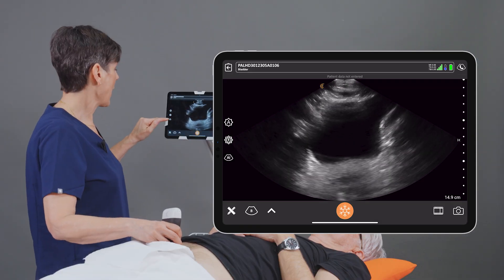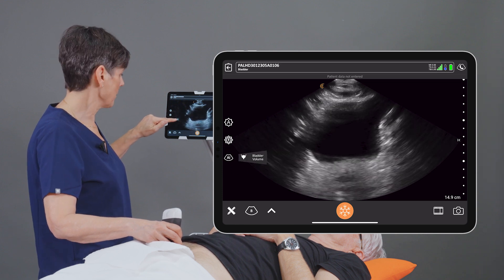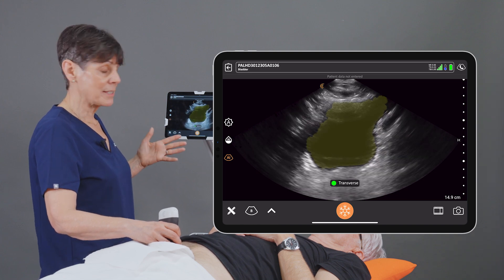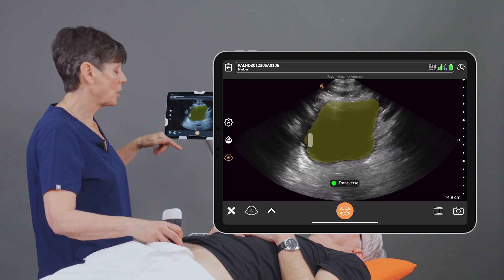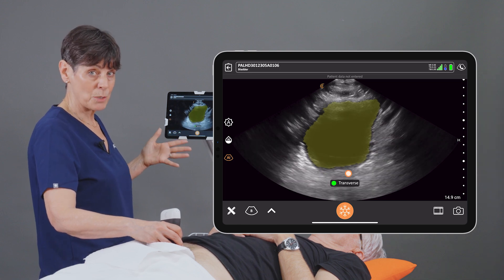Now that I'm scanning, I'm going to activate the Bladder AI by clicking on the AI icon, and we'll see an overlay that identifies the bladder. Now I can adjust the opacity of this overlay if I like. You'll also notice that the AI is identifying this as a transverse image, which is accurate.